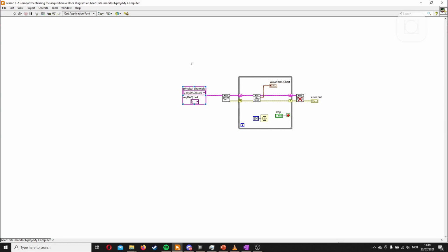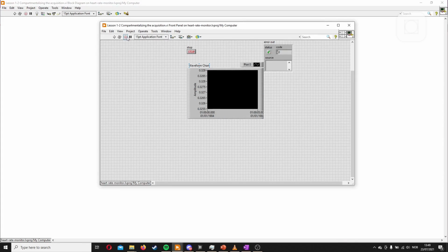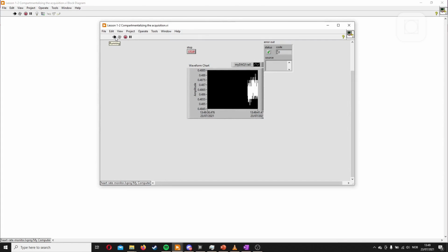And before we stop, we need to test if it works. We'll just go back here and then test. And we'll see it reads some data. I'll try to mess with the input and we see it reacts to my messing with it. Tap, tap, tap, tap, tap, which means it works. You can also see now we have the actual time up here because it's a waveform.